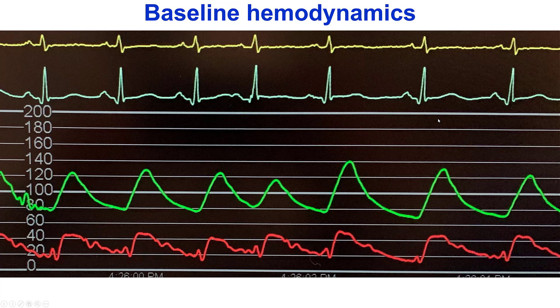In such patients who are at high risk, we always like to perform right heart catheterization at baseline — first to assess their baseline hemodynamics and the need for hemodynamic support, but also to monitor the progress of the case and get an early warning if things are not going well. In this particular case, the PA was slightly over 40, with a PA diastolic of around 20.